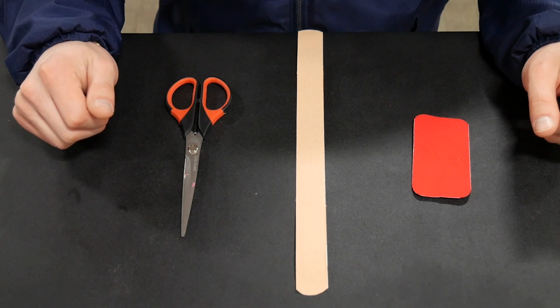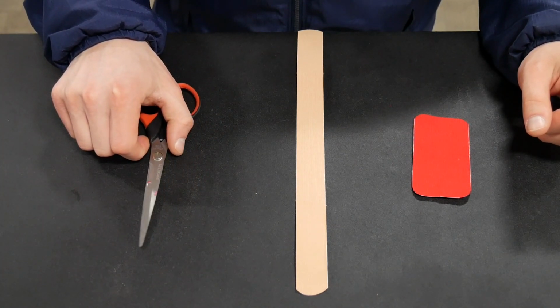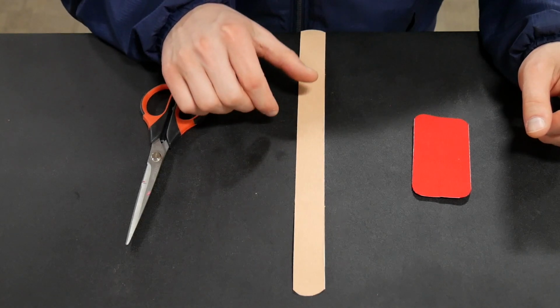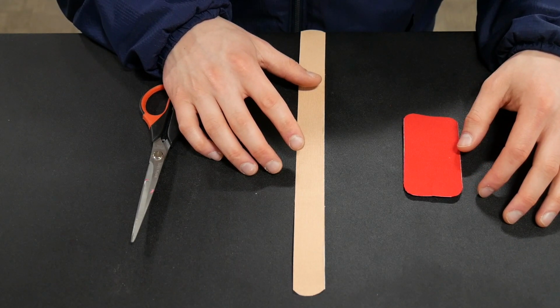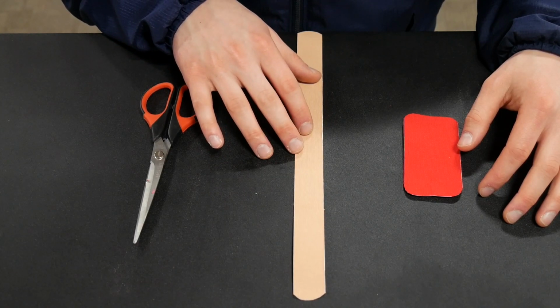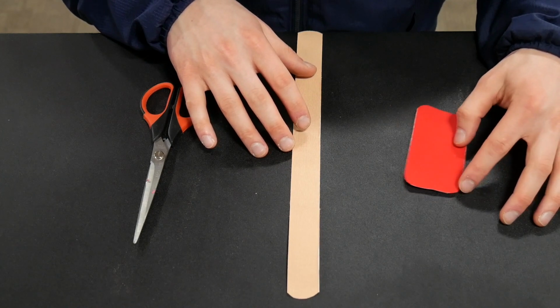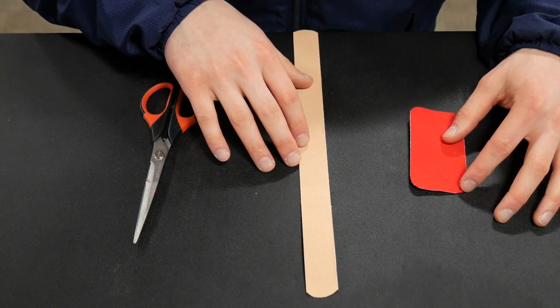Okay guys, so for this taping application we're going to need, of course, a pair of scissors to cut the tape, and you're going to need two pieces of tape: one longer, thinner piece, and one shorter, wider piece. They do sell the 1-inch width tape, which is ideally what you would want for the longer piece, but if you don't have that available, you can take a 2-inch piece like this and cut it in half lengthwise to get your narrow piece of tape.